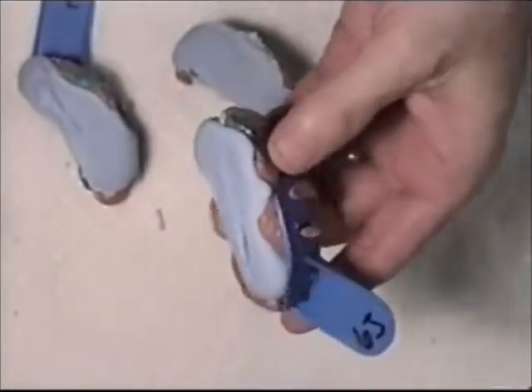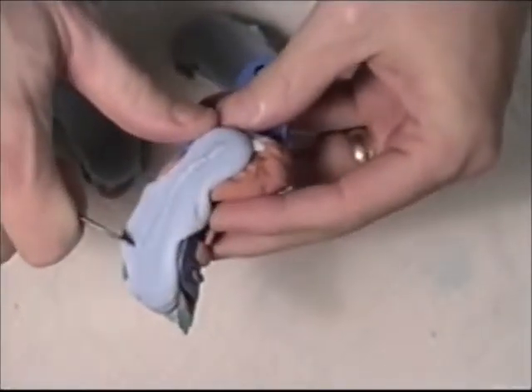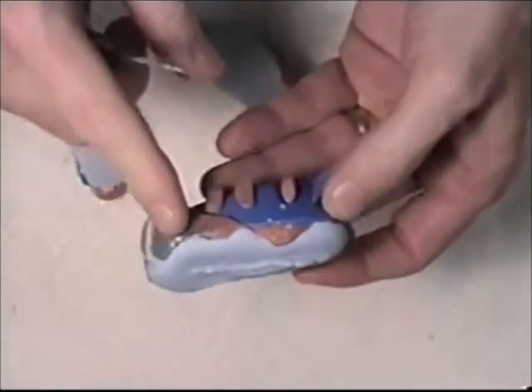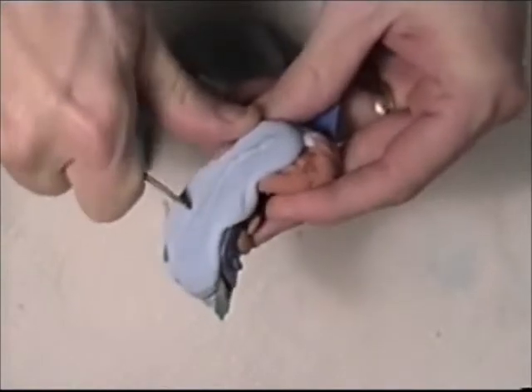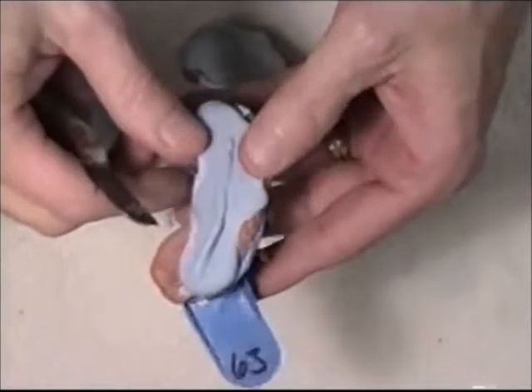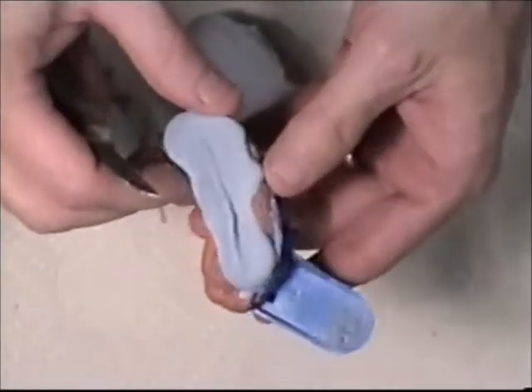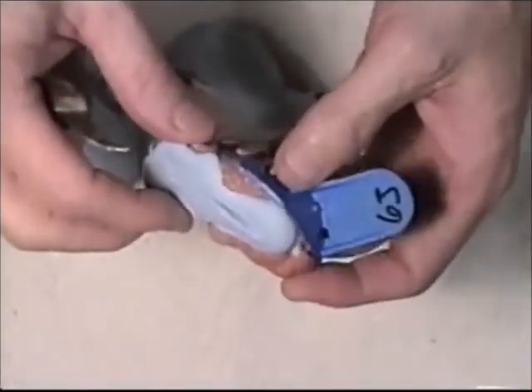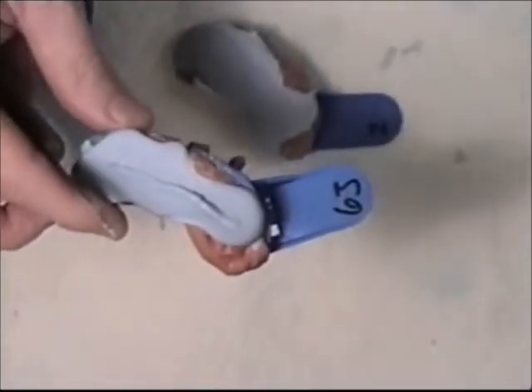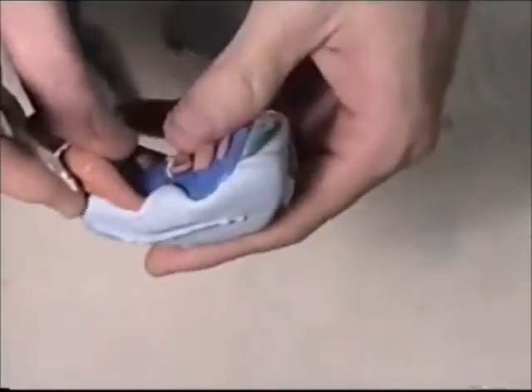The stone I poured into my impressions has hardened. You can usually tell if it's a good time to separate the die stone material from the impressions by scratching it with the knife — it should not be warm or hot, because if it's still warm, the stone is still setting up. You don't want to separate it too early. It's been about 15 minutes since I poured the stone, so now it is time to separate them.